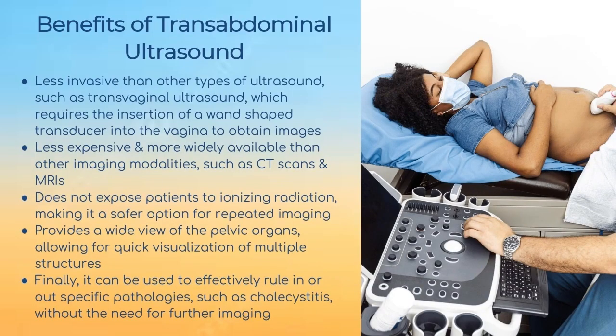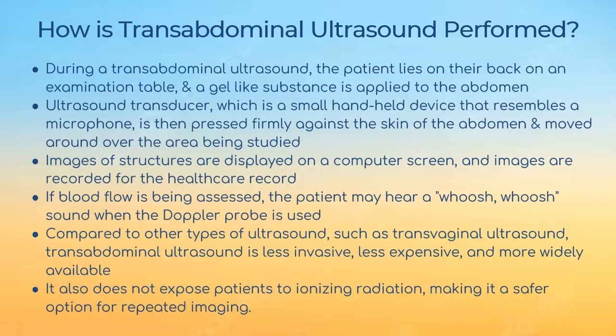There are many benefits to transabdominal ultrasound. It's less invasive than other types of ultrasound, such as transvaginal. It's less expensive and more widely available than other imaging modalities, such as CAT scans or MRIs. It does not expose patients to ionizing radiation, making it a safer option for repeated imaging. It provides a wide view of the pelvic organs, allowing for quick visualization of multiple structures. And finally, it can be used to effectively rule in or out specific pathologies, such as cholecystitis, without the need for further imaging.